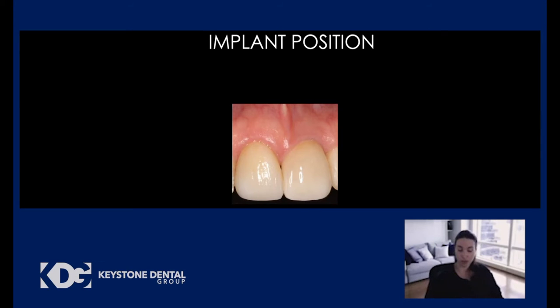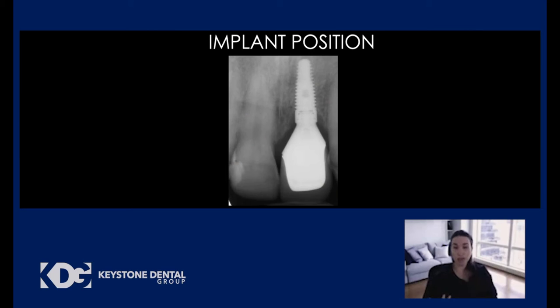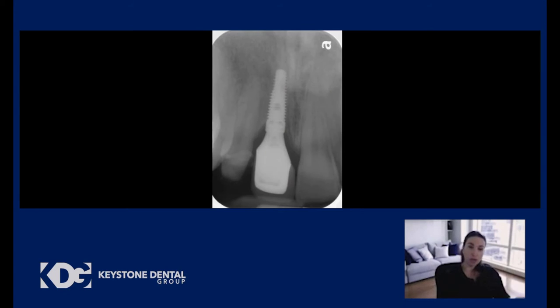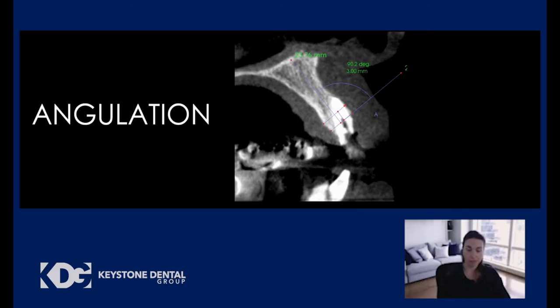The first one will be the implant position. We want the implant to be positioned in a way that will allow us to have enough emergence profile, or a good running room, to create a good emergence profile in a smooth way. We don't want any sort of sharp angles. We want to create that emergence profile in a way that really supports the tissue. So that subgingival contour is going to be very important for us to get a good esthetic result. Usually, a good guideline is if we draw an imaginary line joining the CEJ of the adjacent teeth, we want the implant to be placed at least 3 millimeters below that CEJ. That will be a guideline for implant placement.